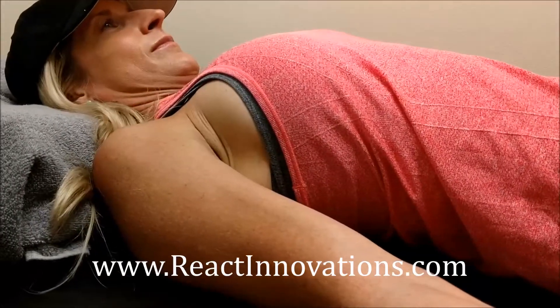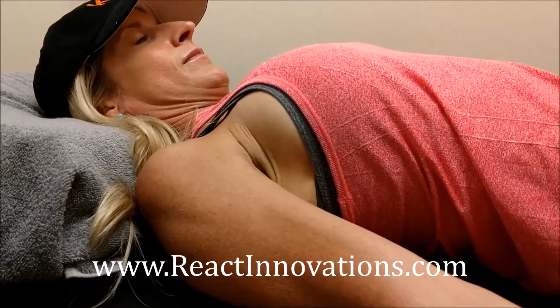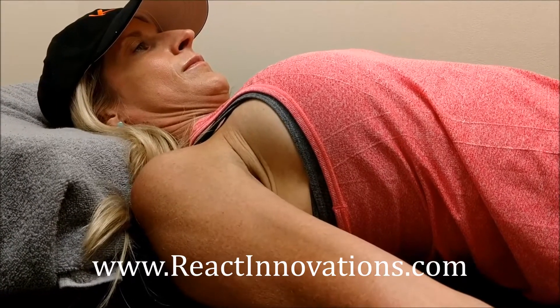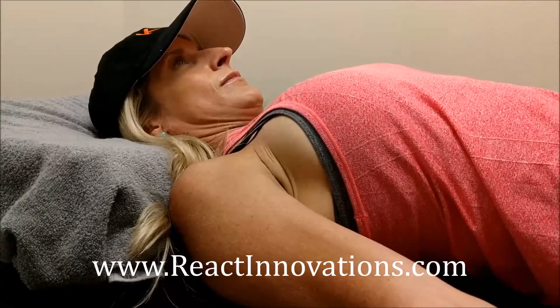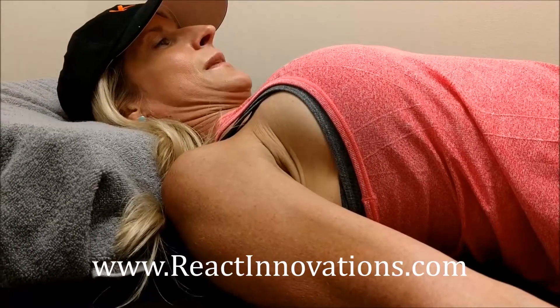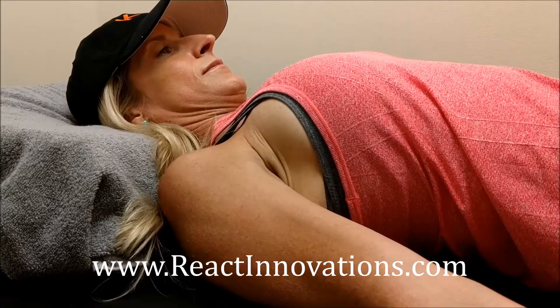For spots such as the supraspinatus, other areas in the rhomboid and AC joint, we're able to effectively treat those with no stimulation of pads, needles, or lasers — simply a magnetic pulse that depolarizes the nerves and creates a contraction between the brain and the muscle grouping. Tremendous effects for rehabilitation, increased blood flow, muscle strengthening, and muscle re-education.